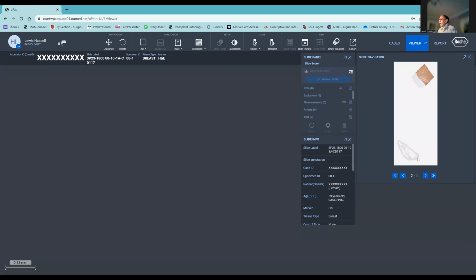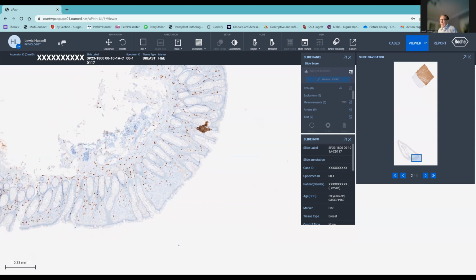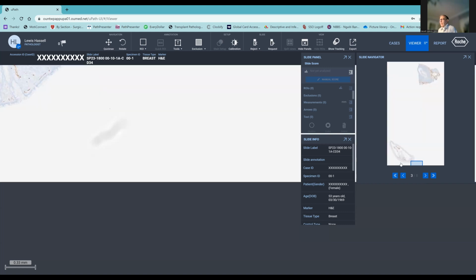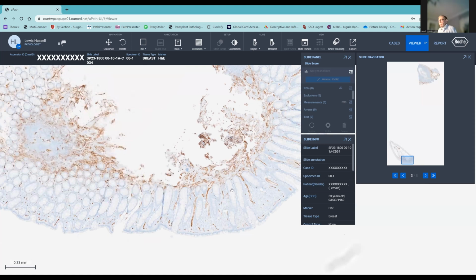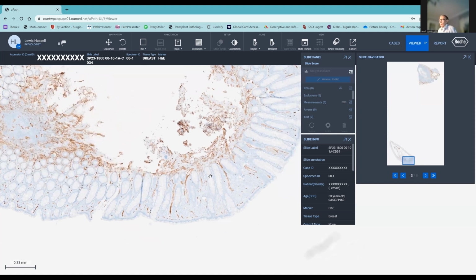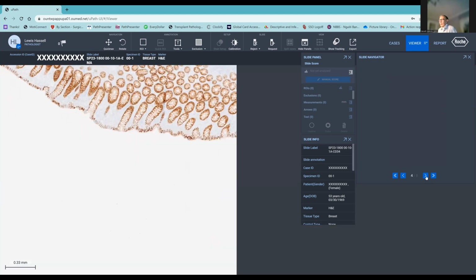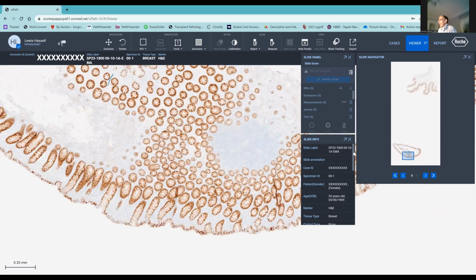You can see here is a stain for CD117. As you can see, it's lighting up some of the mast cells here, but not at all touching this lesion in the lamina propria. Here, a stain for CD34, to rule out GIST, or solitary fibrous tumor. Again, we're not seeing much uptake here, just the normal vascular pattern. And another stain here we did was an epithelial marker. Some of those lesions in our differential have epithelial markers.